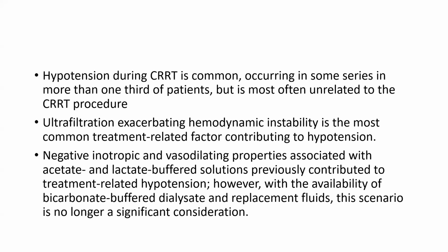Hypotension during CRRT is common, occurring in some series in more than one-third of patients, but is most often unrelated to the CRRT procedure. Ultrafiltration exacerbating hemodynamic instability is the most common treatment-related factor contributing to hypotension. Negative inotropic and vasodilating properties associated with acetate and lactate buffer solutions previously contributed to treatment-related hypotension. However, with the availability of bicarbonate buffered dialysate and replacement fluid, this is no longer a significant consideration.